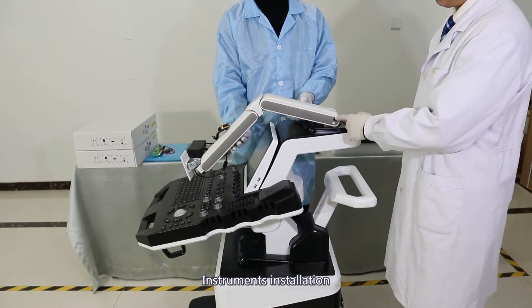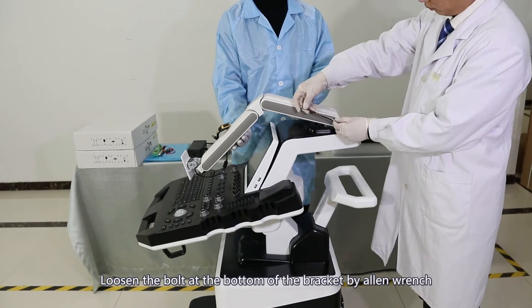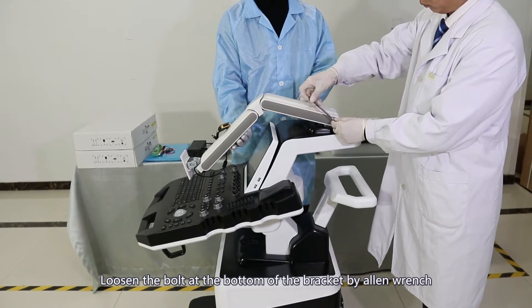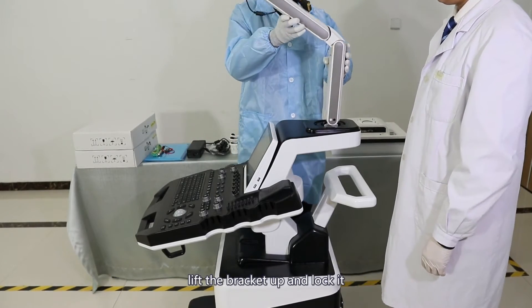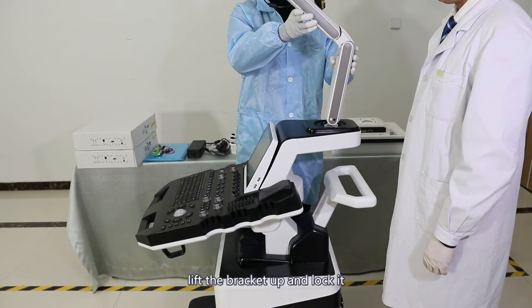Instrument installation. Loosen the bolt at the bottom of the bracket using an allen wrench. Lift the bracket up and lock it.